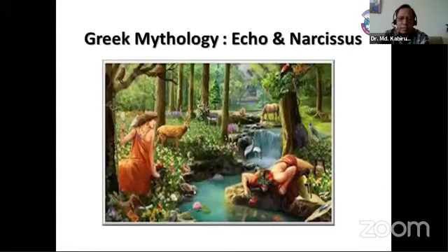After discussion of so many learning topics, I want to just relieve the imagination center. This is the drawing from Greek mythology. She is Echo, the symbol of sound, and he is Narcissus, the most handsome man in Greek mythology, who sees his own image in water, tries to capture it, and dies. So he is the symbol of image, and she is the sound. So echo is composed of sound and image.